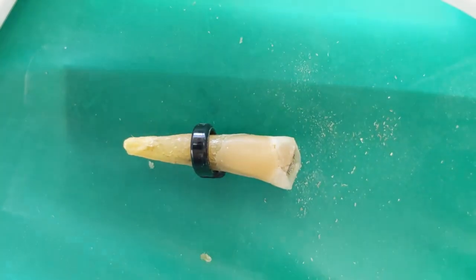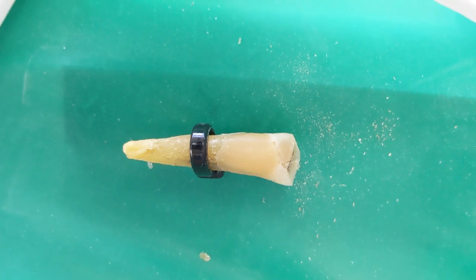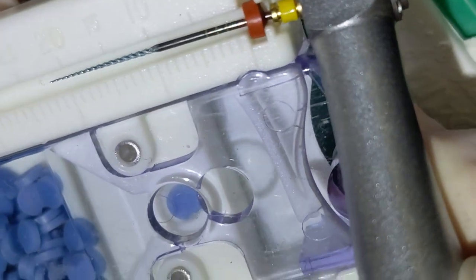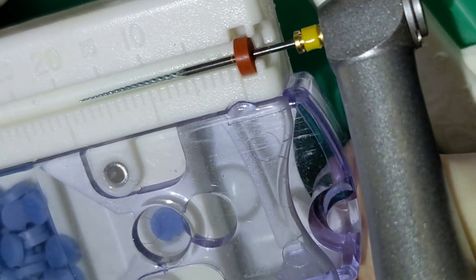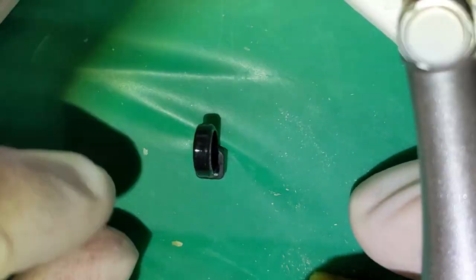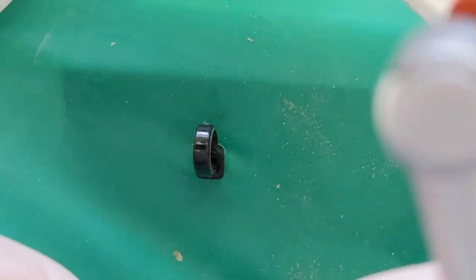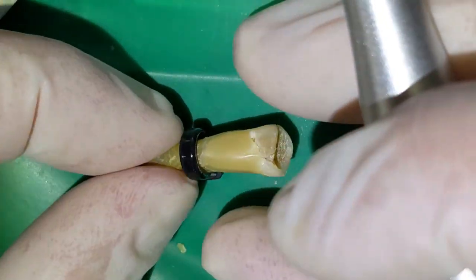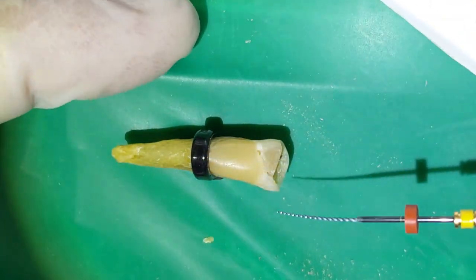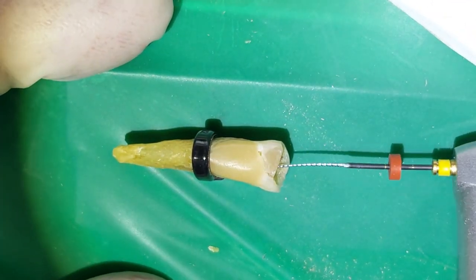Okay, so then on to the next file. Next file is a number 20. So check the length, and again, we want that to be about 24 millimeters. So this file is the next one, a little bit bigger.